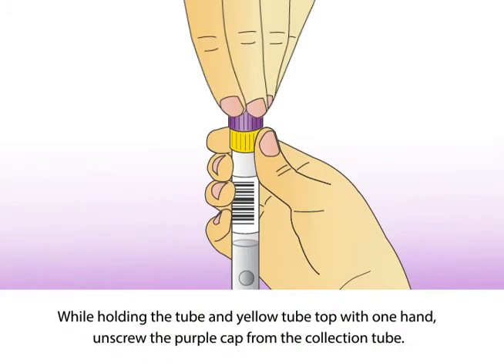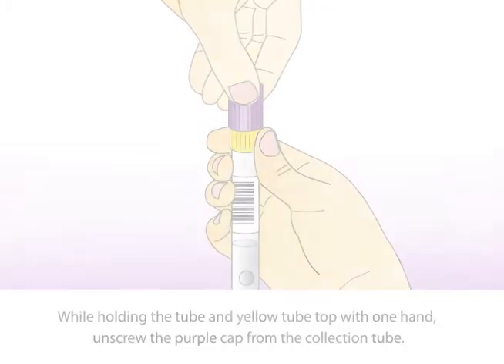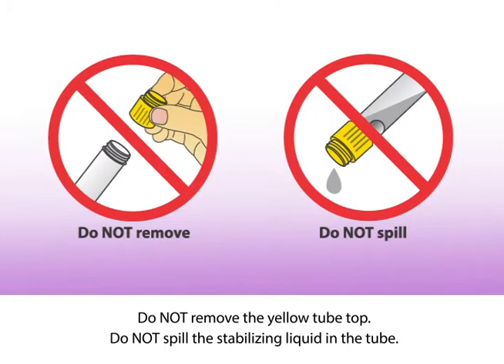While holding the tube and yellow tube top with one hand, unscrew the purple cap from the collection tube. Do not remove the yellow tube top, and do not spill the stabilizing liquid in the tube.